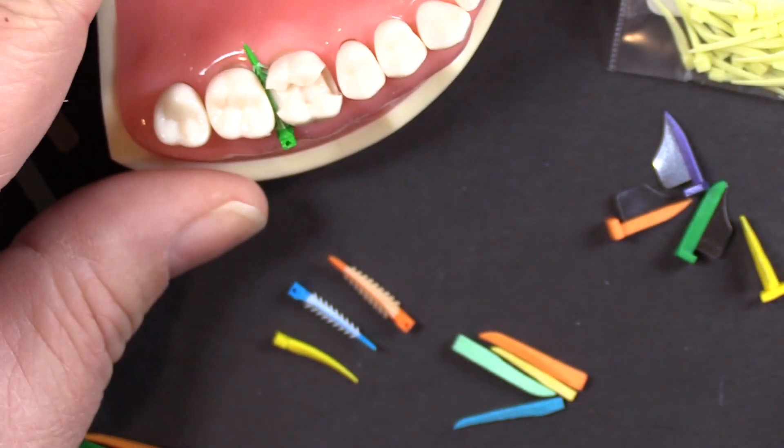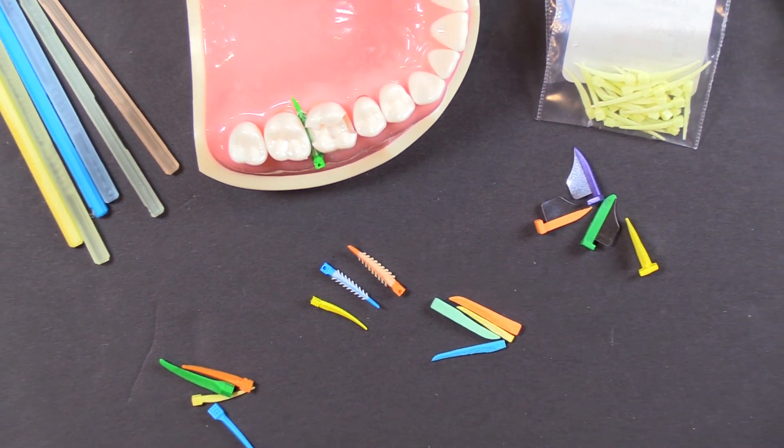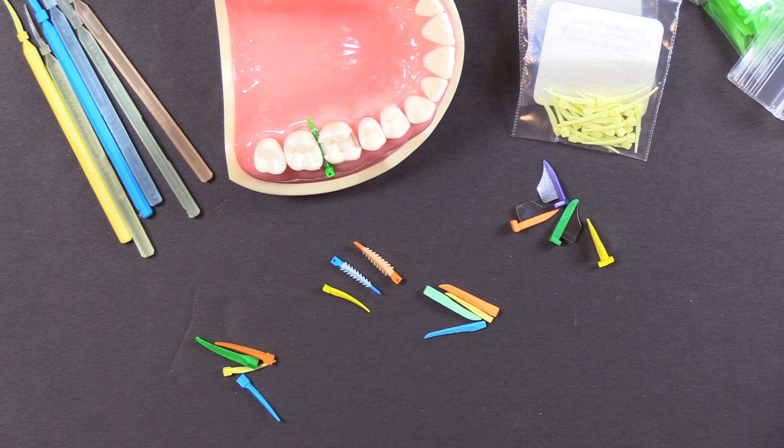That covers the wedges we currently have — I'm sure in the future we'll have more to add. This also covers the primary question of whether you have to use a Garrison wedge with a Garrison sectional matrix system. No, you do not. They are certainly designed to be used with Garrison systems, but the most important thing is finding a wedge that works well in your hands. I would encourage you to try several different varieties of the newer wedges, because they have some great advantages that will make your dentistry easier.